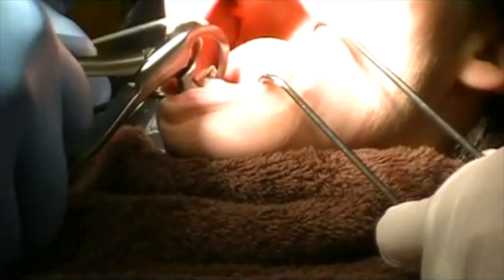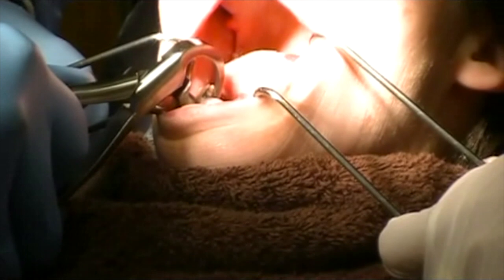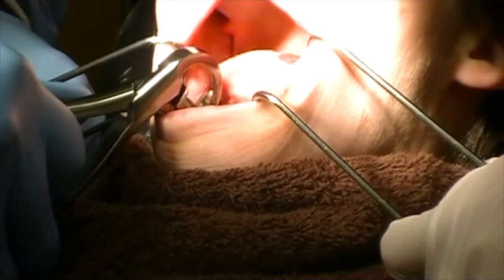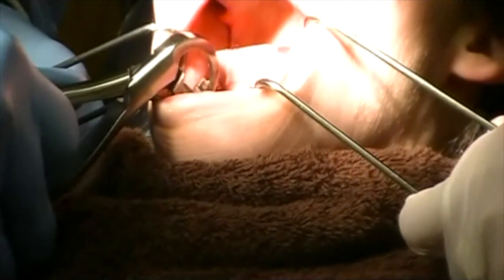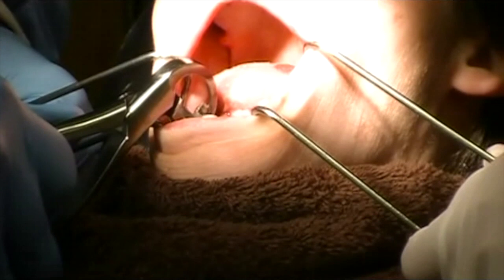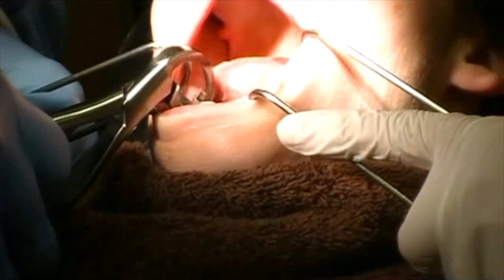Way up in the air — your chin — there you go. You need a little room for your wrist to rotate. We're doing the cuspid, and just real slow, chin up again. And I'm just using rotating pressure again.